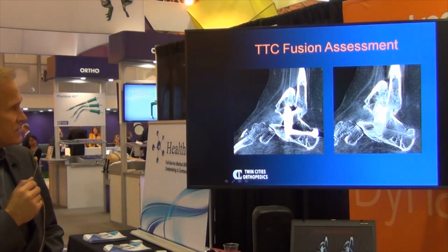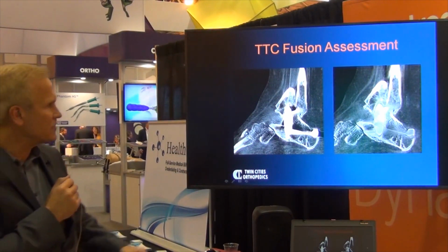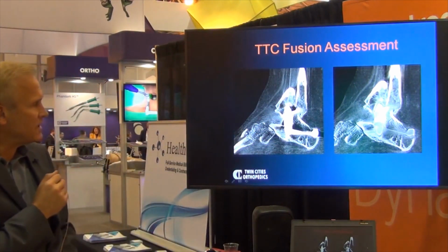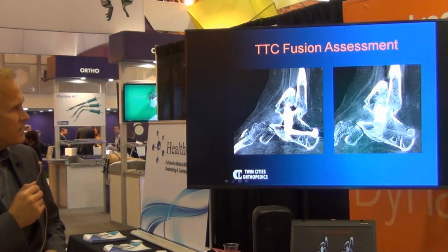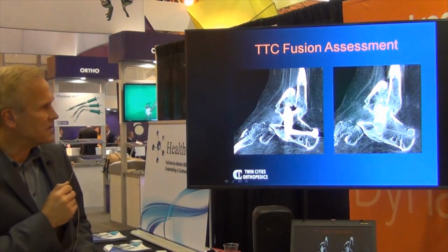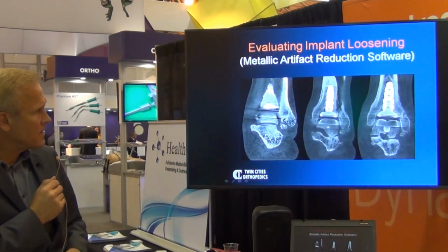So here's another example of the metallic artifact reduction software. Here's one where I'm trying to evaluate more around this area to see whether or not there's been adequate healing to a TTC fusion with bulk allograft. And again, here's without the MAR and here's with the MAR. You can see that there's much less scatter associated with that. So again, another benefit of that kind of software.